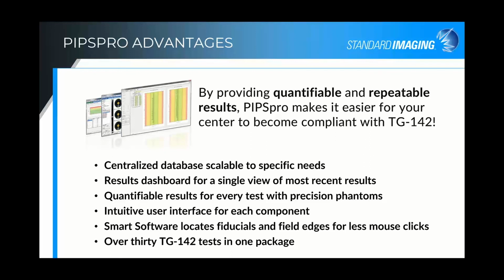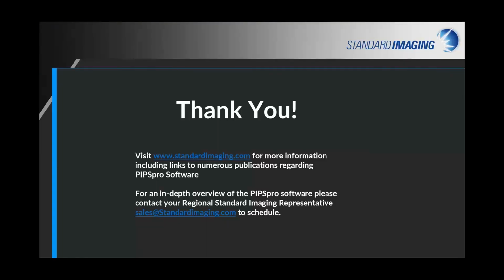And then, as I mentioned, it also has that automatic upload into our QA pilot software. If you want, keep an eye on our webinars page. We do offer a QA pilot webinar on pretty much a monthly basis as well. You can track that and schedule and register for that, similar to registration for this webinar here. Our product manager for the QA pilot software will run through that for you. But other than that, that's all I've got today.